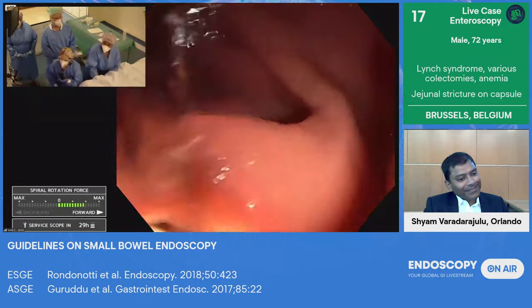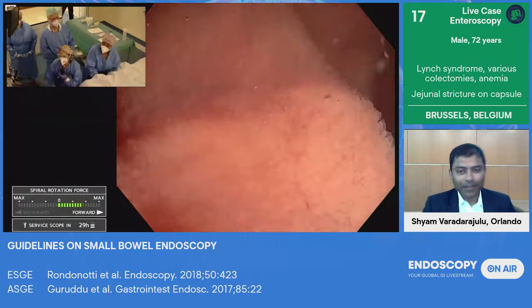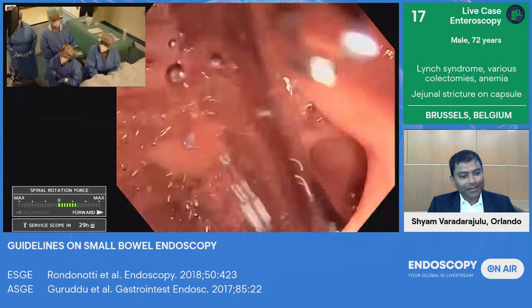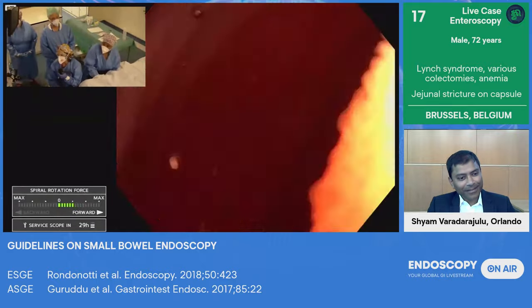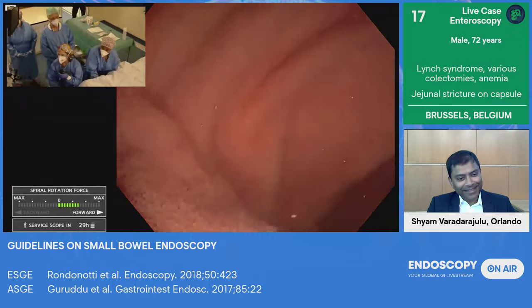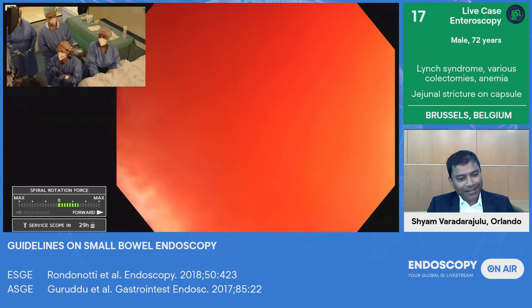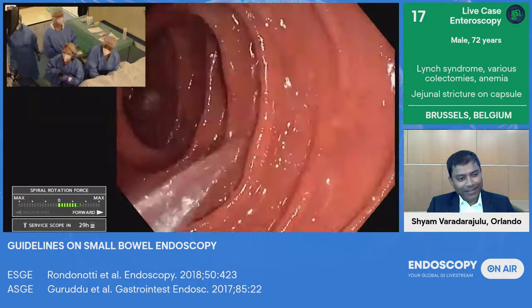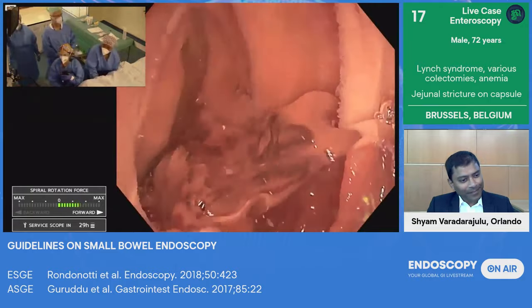There are some anatomies which are more adequate for excess speed, but I never calculated. This is a tough question. Usually what we do is we ask one of our nurses to count the folds. They spend a lot of attention to count the folds. Then we say 9 millimeters per fold, and then we do the estimation. But it's very, very approximate. You see, it's really advancing by itself.